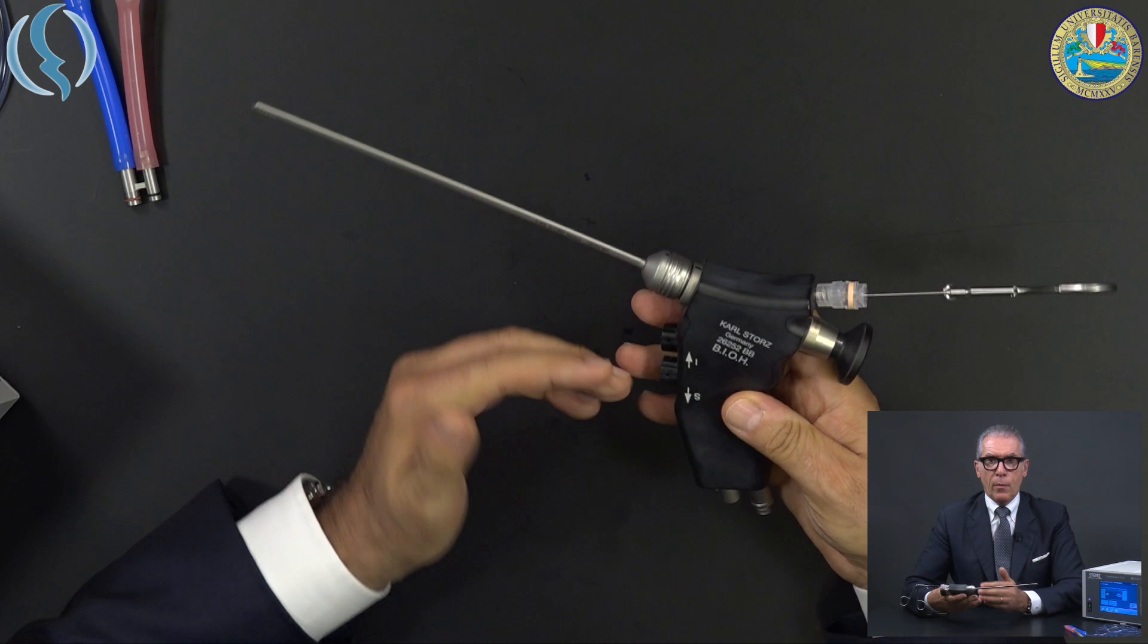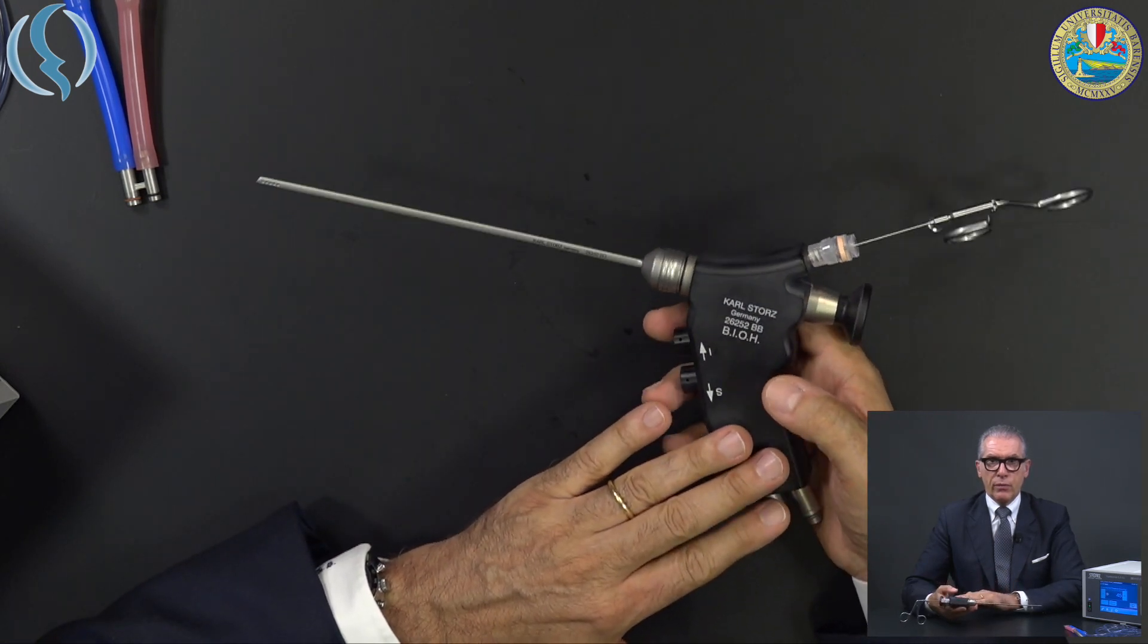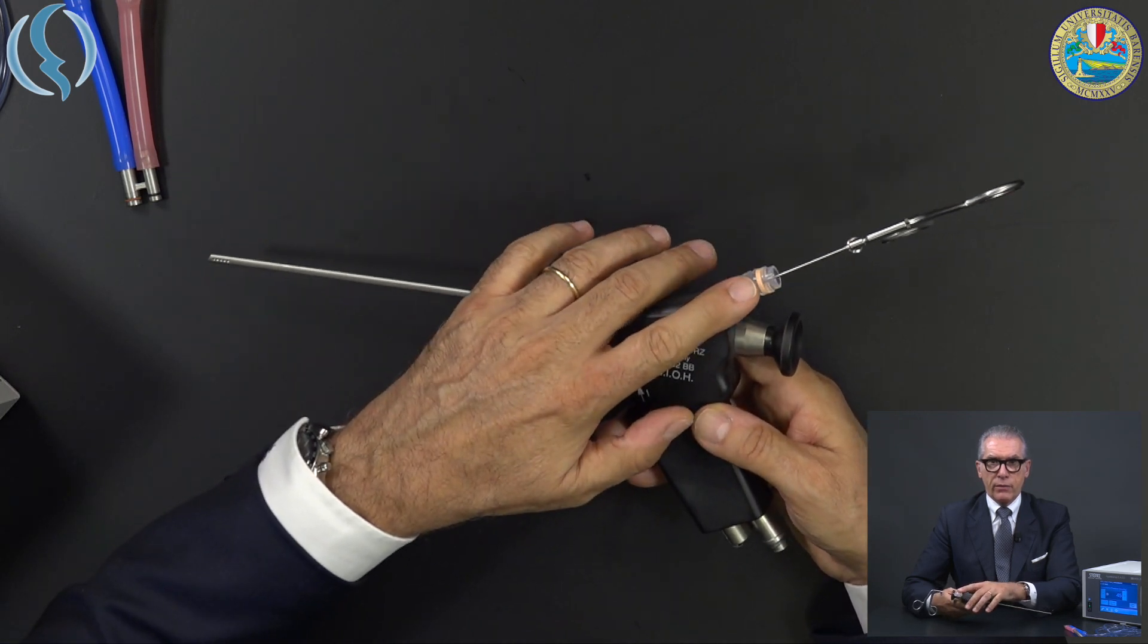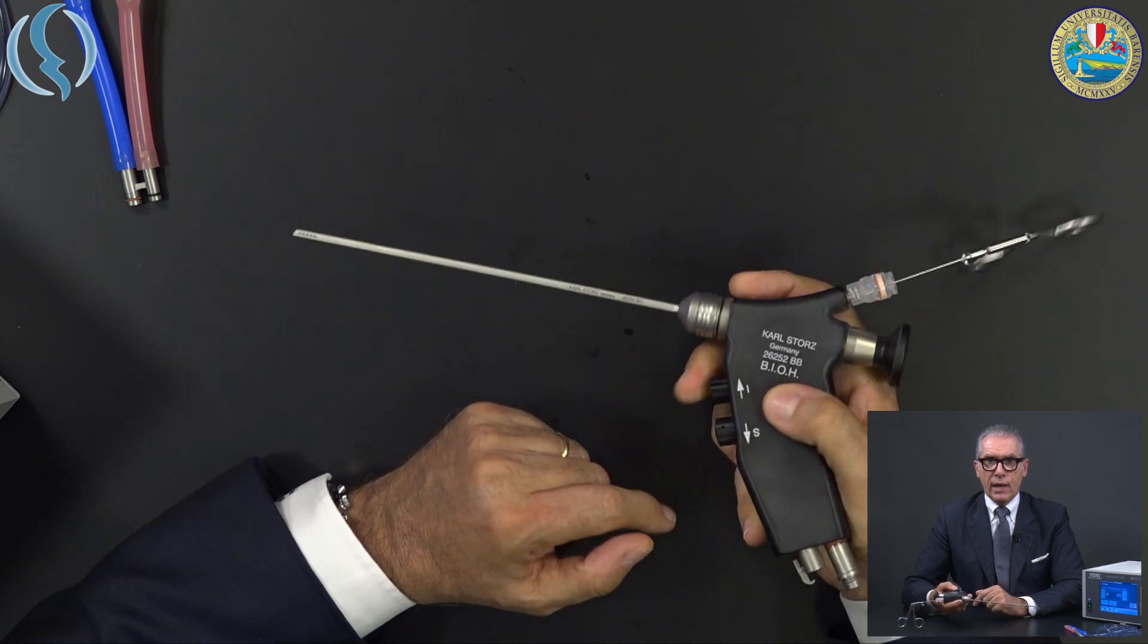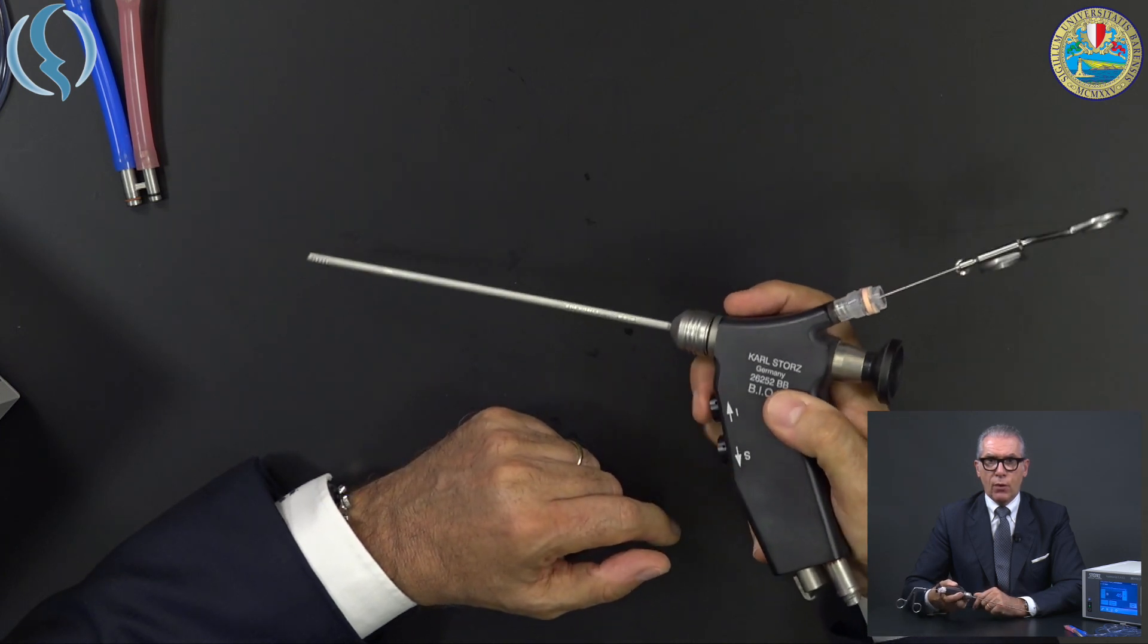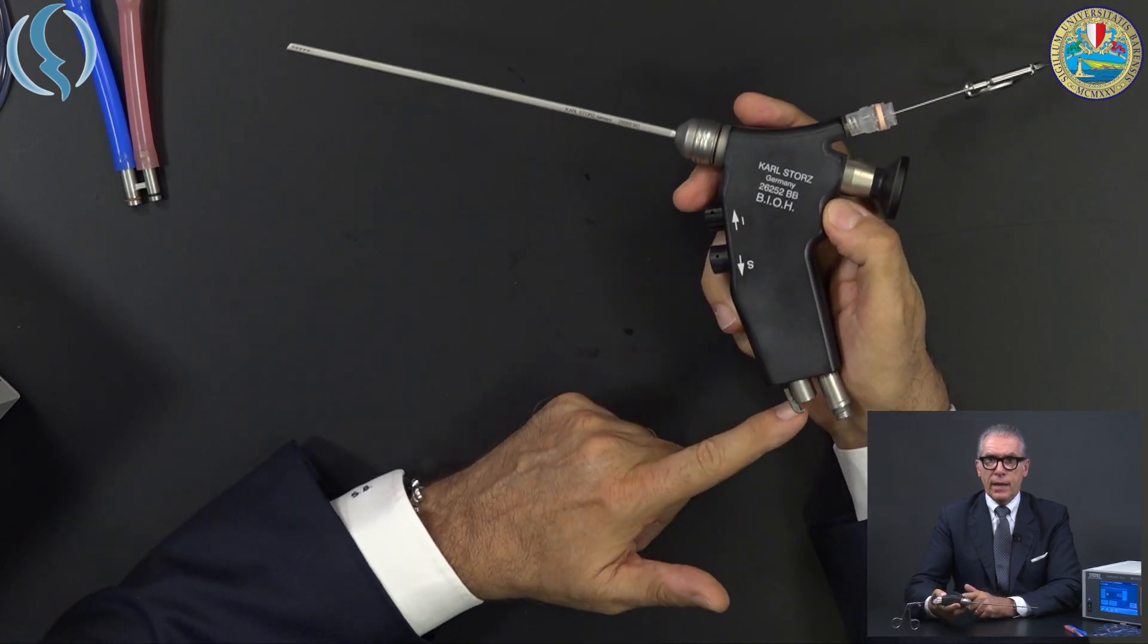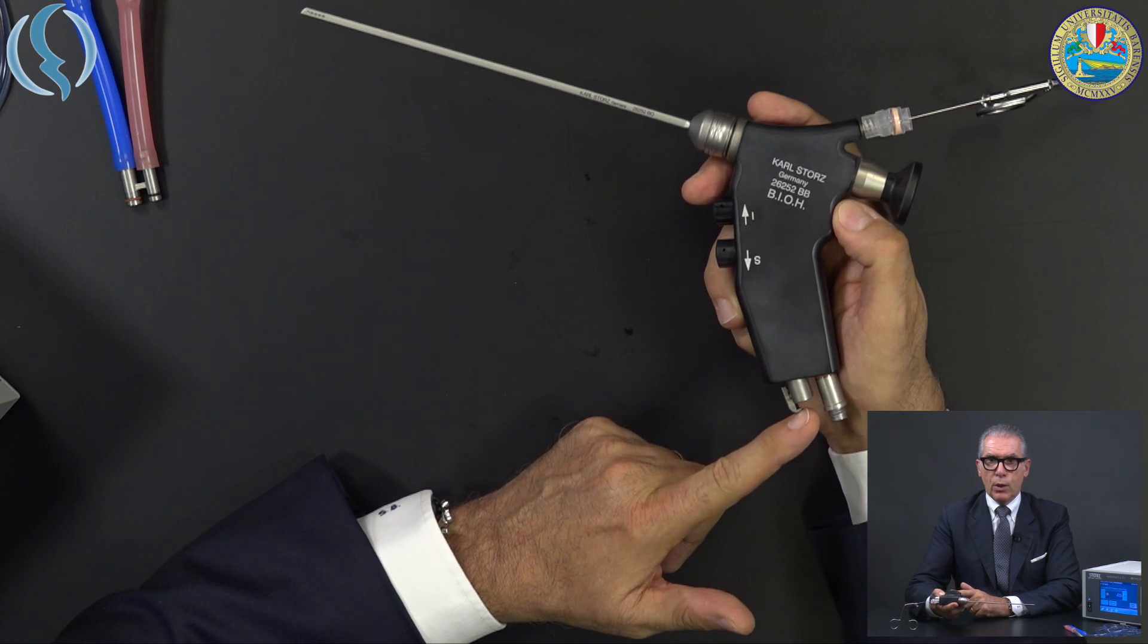A handle where I concentrate all the connections that usually in the previous scope were around the sheath and around the operative channel. We have first the two valves that control the inflow and the outflow here. And this is the light cable connection and this is the so-called monoblock connector.